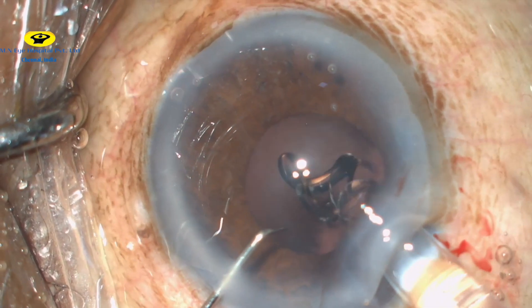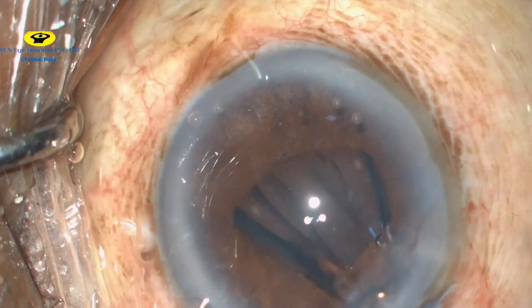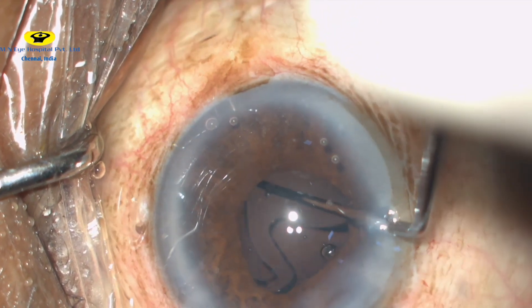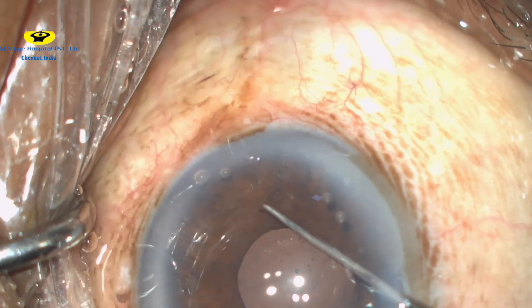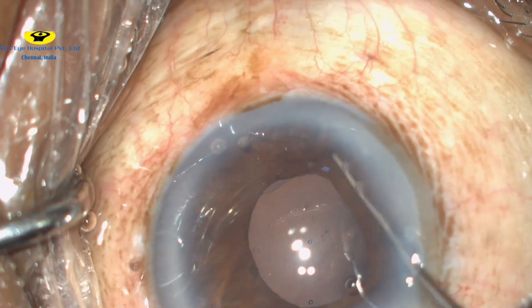The foldable intraocular lens is gradually inserted into the capsular bag and the trailing haptic is dialed into the bag. The iris is then retracted from all sides to make sure that the intraocular lens in all its entirety is present within the bag.